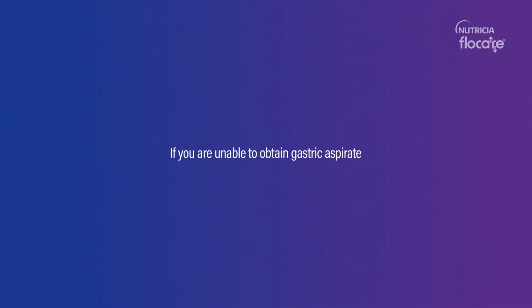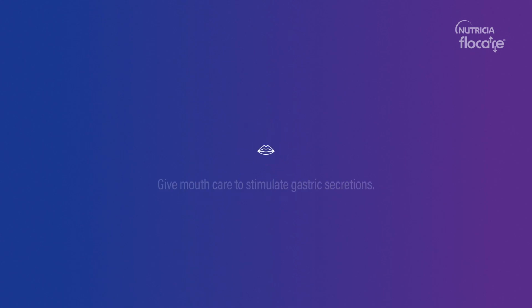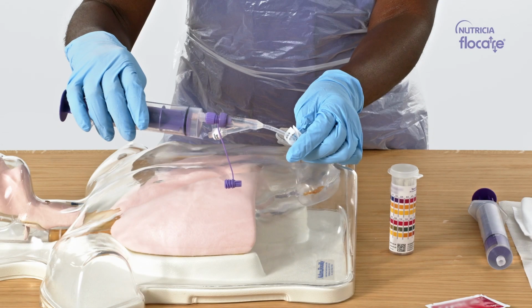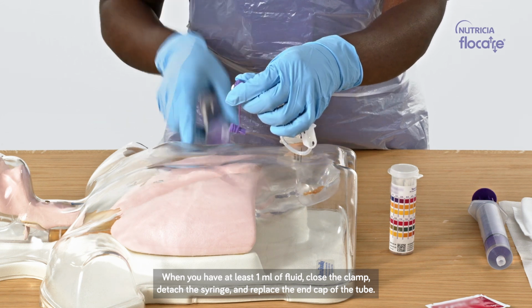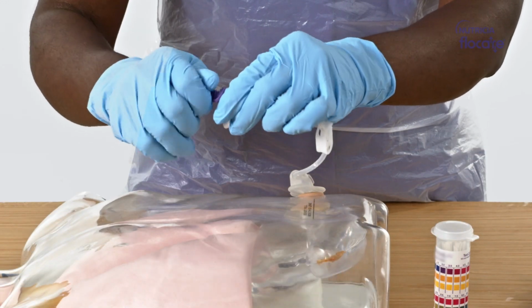If you are unable to obtain gastric aspirate, ask the patient to lie on their left side for 15 minutes, or try giving mouth care to stimulate gastric secretions. If it's still not possible, do not replace the tube and contact your managing healthcare professional for advice. When you have at least 1 ml of fluid, close the clamp, detach the syringe, and replace the end cap of the tube.